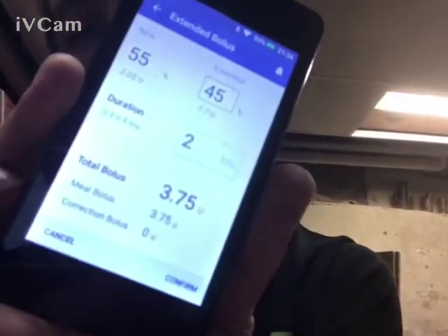Once you select that amount, you have to confirm it — it lights up. And it will tell you right away: immediately it's going to give you 2.05 units, and then over the next however-long duration you set — in my case 2 hours — it would give me the remaining 1.7 units.